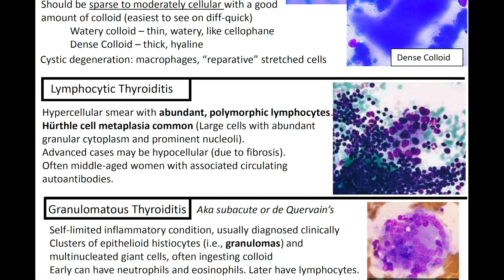Next up, we've got lymphocytic thyroiditis. You're going to see a hypercellular smear with abundant polymorphic lymphocytes, as we're seeing here. Hürthle cell metaplasia is common — these are large cells with abundant granular cytoplasm and prominent nucleoli. In advanced cases, it may be hypocellular due to fibrosis. Lymphocytic thyroiditis often occurs in middle-aged women with associated circulating autoantibodies.